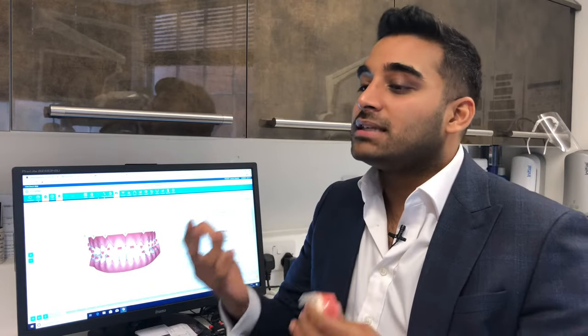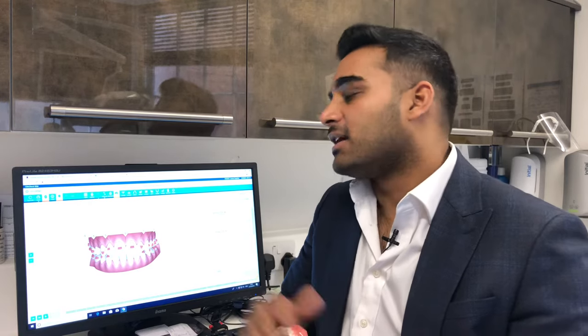We don't take any teeth out, which is great. This just creates enough space for the teeth to move amongst themselves into the right sort of alignment.